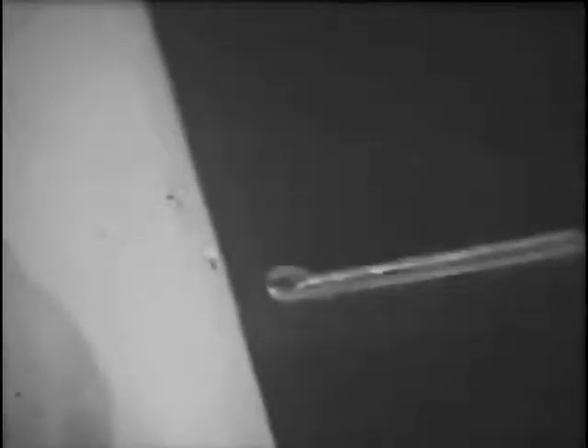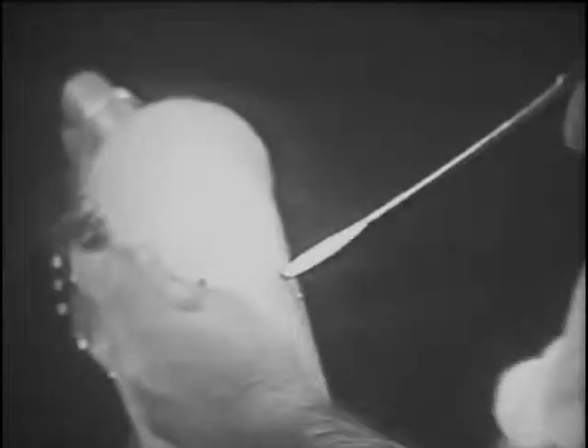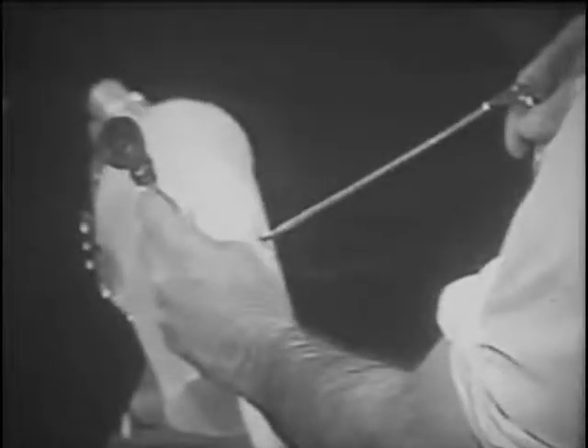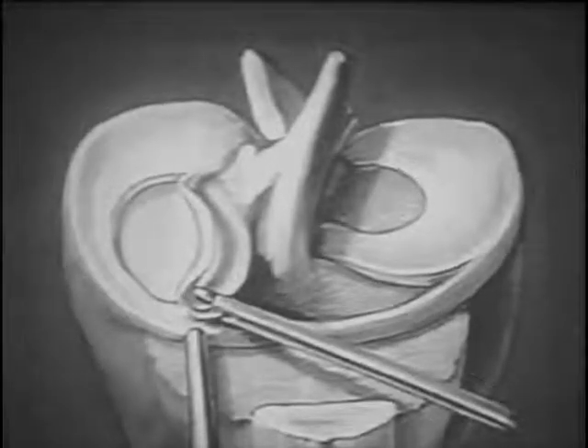A five millimeter hook scissors replaces the nerve hook and is inserted through the lateral puncture wound. The diagnostic scope remains in the medial joint. Diagrammatically, the five millimeter hook scissors comes across to the anterior portion of the medial meniscus.